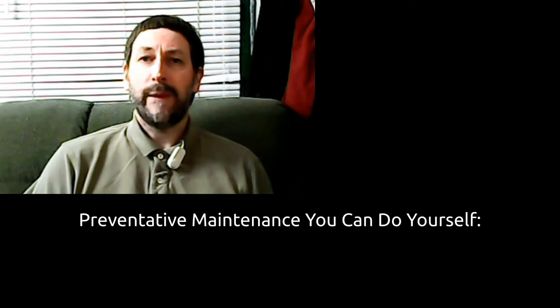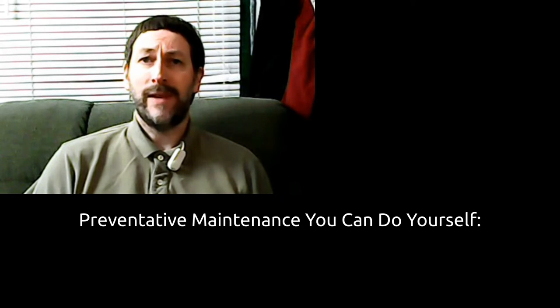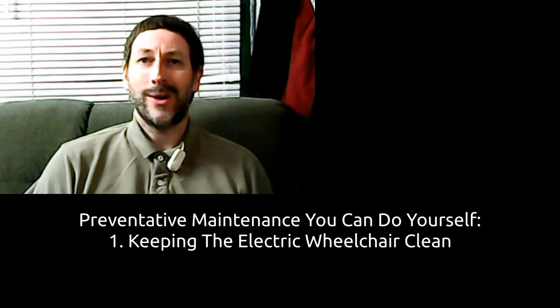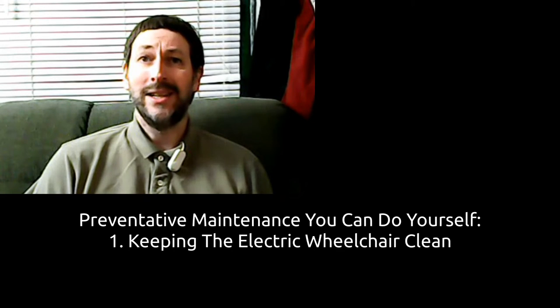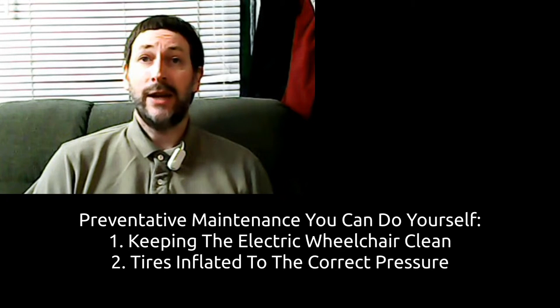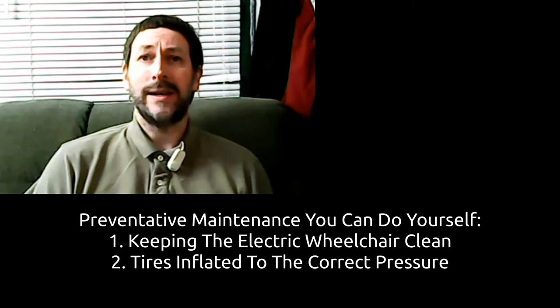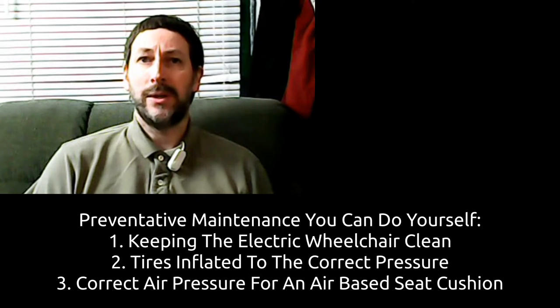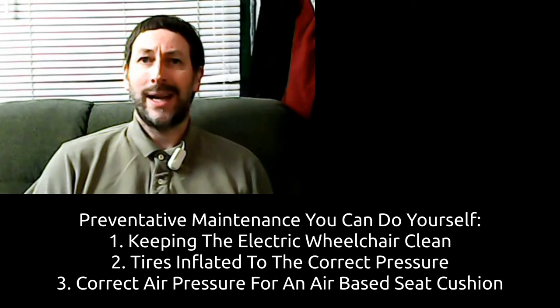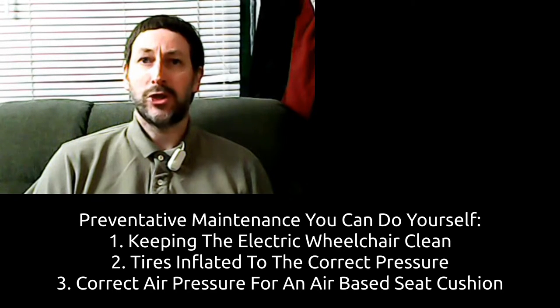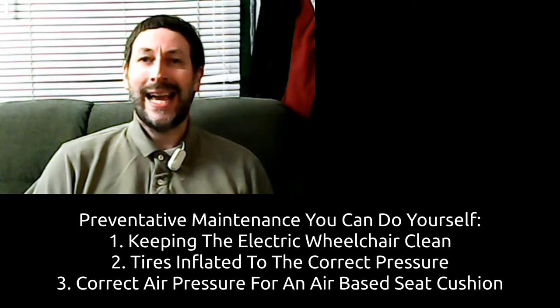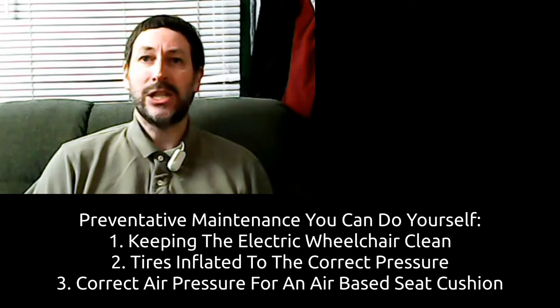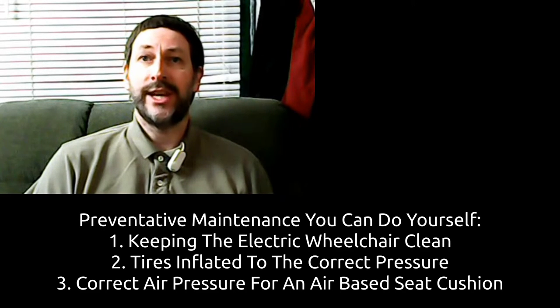The only preventative maintenance you can do yourself is keeping the electric wheelchair clean, tires inflated, and, if applicable, the correct air pressure in an air-based seat cushion such as the Roho brand.